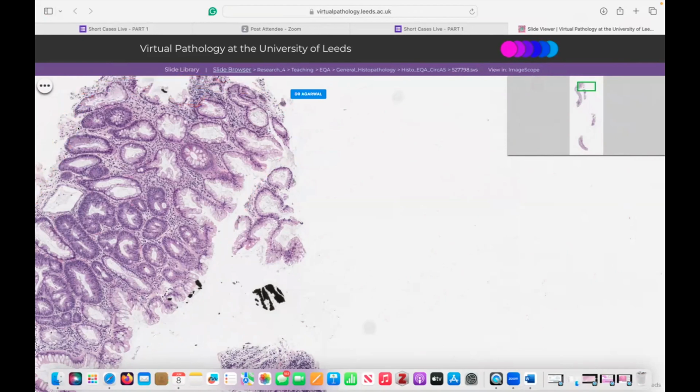And look at this. These are all serrations. Can you see this zigzag? See this star-shaped lumen. And look at this focus. They look very benign. And here also, here they look quite dysplastic. See, this is all dysplasia.